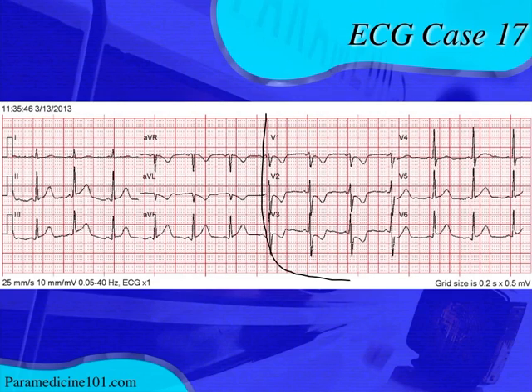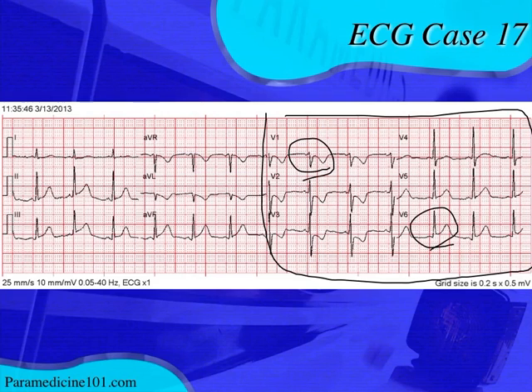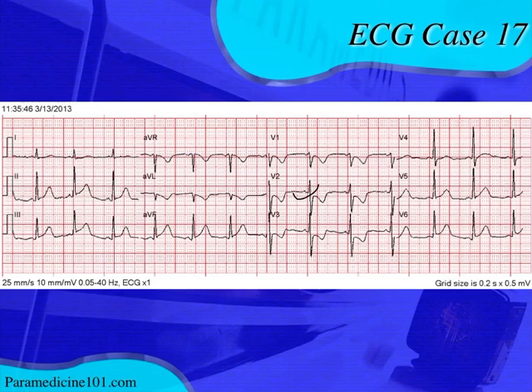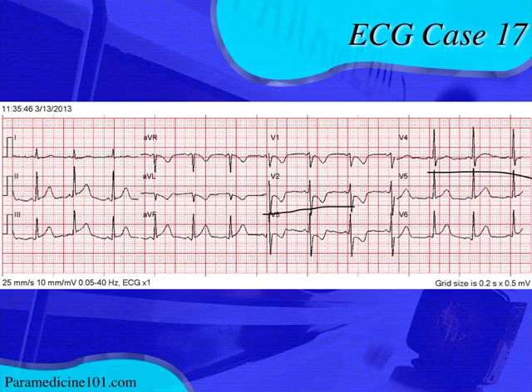Looking at the precordial axis, while it is normal — it does go from a mostly negative QRS complex in V1 to a mostly positive QRS complex in V6 — it is not normal to see these very prominent R-waves in V2. This is sort of an early R-wave progression, though the transition does occur between V2 and V4, so we don't want to say it's early R-wave progression, but we want to pay attention to these R-waves in V2 because they could mean something.